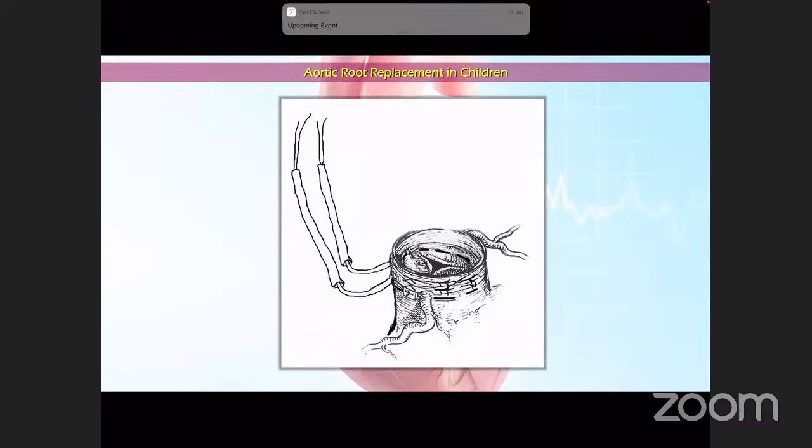So what you can do is put a circumferential suture around the ascending aorta. Say the aortic annulus is dilated and I want to reduce the size. After I do the subcommissural annuloplasty, I check the normal size of the aortic root for this body surface area, and maybe put a Hegar dilator into the aortic root and tie one of the pair of circumferential sutures around the aortic root. And I leave the other on a snare just in case you need to tighten it more.